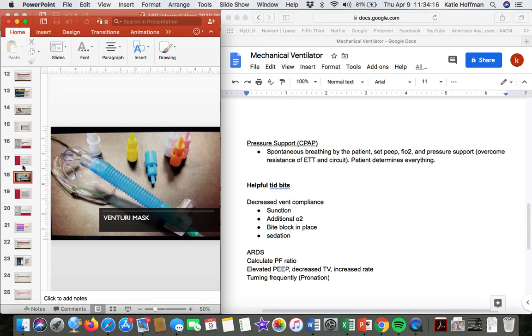Respiratory can help set that up if you need assistance, because you are going to have a couple of different devices to piece together. And on those devices, it's going to tell you the relative flow rate that you will need to achieve the FiO2 that is set. Absolutely, and that's the point that I wanted to touch on with Venturi. RT really will be a huge assistance in helping get patients on these that really just need to be on a Venturi mask, but we mostly use these for travel.